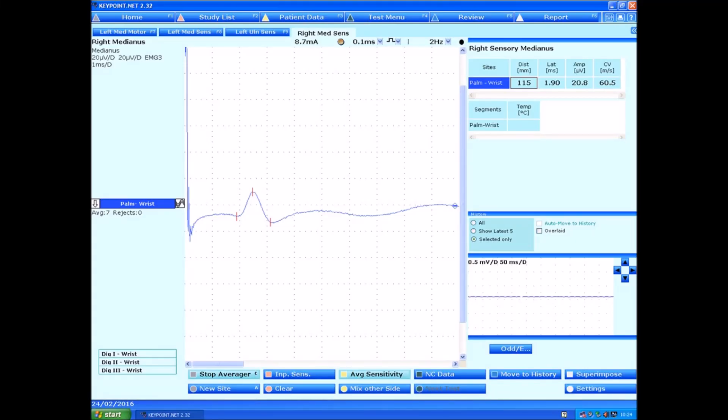If you look on my screen, this is the current as it's passing through the nerve. You can see here it's got a certain size which relates to the axon, the wire of the nerve. And we can use the tape measure to work out the speed at which it's been conducted. In this case, the nerve is conducting the signal at 60 metres a second, and it has an amplitude of 20 millionths of a volt.